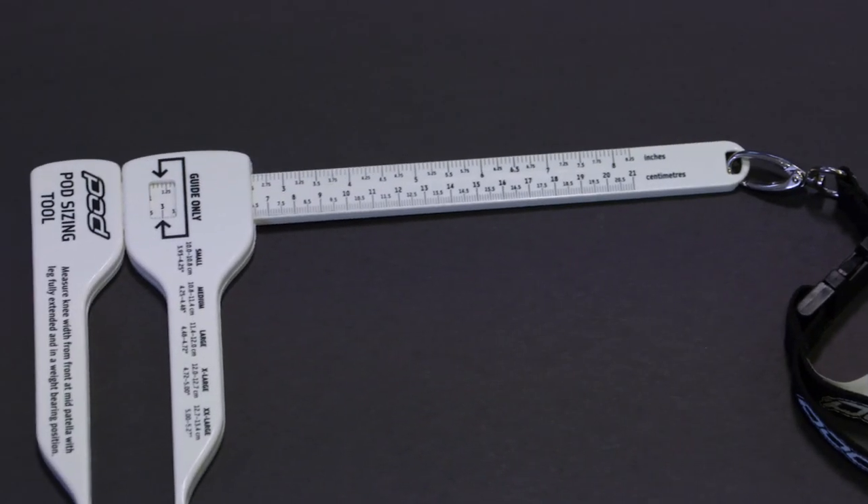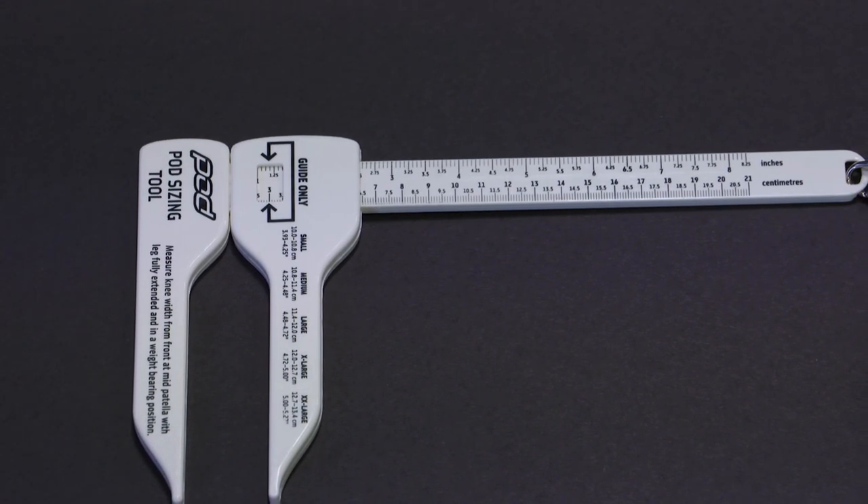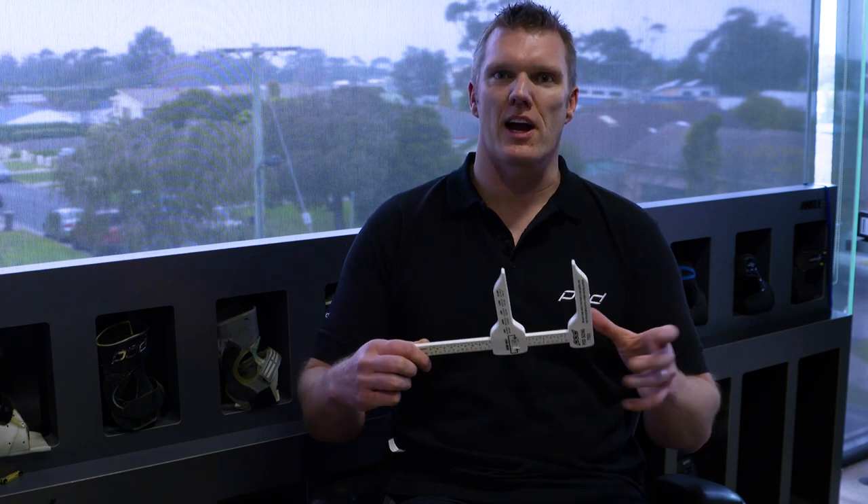If you go into a dealership to get fitted, one of those dealers — a Pod stockist — should have a set of calipers. They will measure the width of your knee and size you up for the correct frame. A lot of people will measure themselves at home so they can order through their local dealer or order online with an e-commerce dealer.